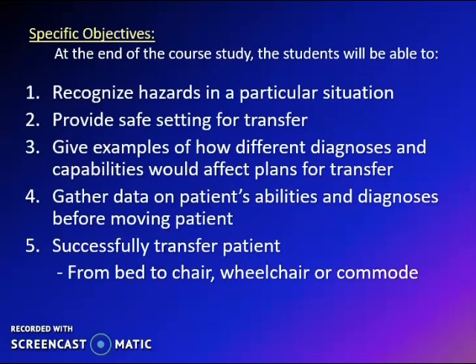Specifically, at the end of the course study, the students will be able to recognize hazards in a particular situation, provide safe setting for transfer, give examples of how different diagnoses and capabilities would affect plans for transfer, gather data on patients' abilities and diagnosis before moving a patient, and successfully transfer a patient from bed to chair, wheelchair, or a commode.